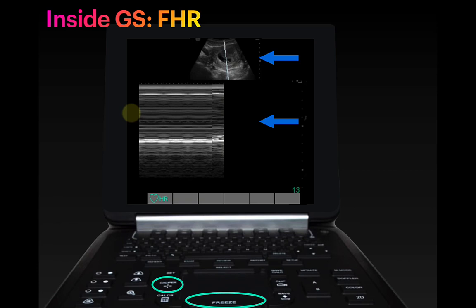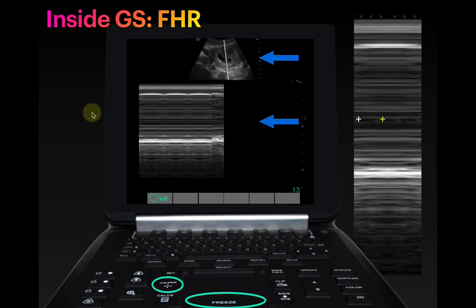So one quick little trick that I can show you is that if you look up here at this little thumbnail picture of the ultrasound, you can actually see where the fetus is. And it's right between 4 and 5 centimeters on the measurement. If you look down here on your M mode scale, between 4 and 5 centimeters, right here is this cute little tiny tracing where you can see those two little black and white pixels fighting it out. So here's black, here's white, here's black again. You want to put your calipers at the beginning of some sort of repeating pattern.